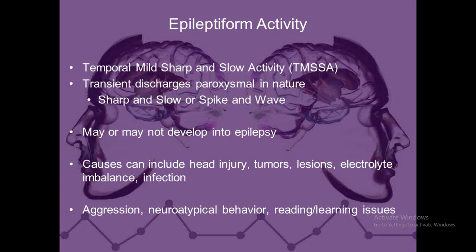I've done 2,600 EEGs now, and in some of these cases that Dr. Proler calls, I don't see it initially. They're not big and paroxysmal, but they're still very, very important. And when he calls them, they're something we should pay attention to.